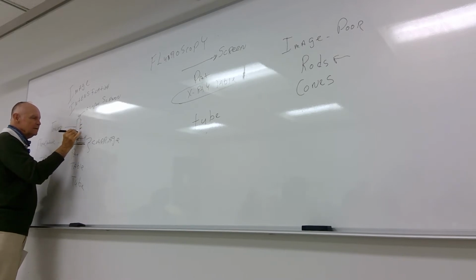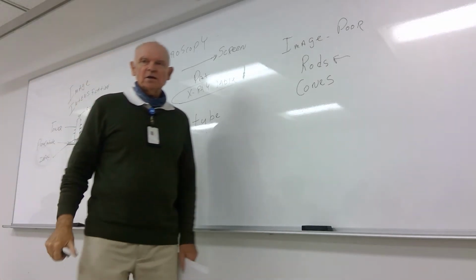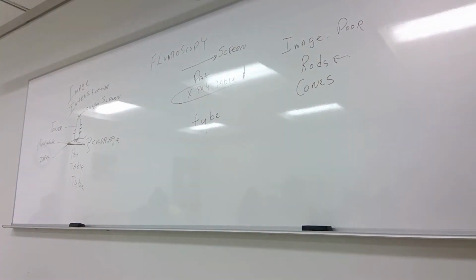I like your thinking, but no. There's something there called electrostatic focusing lenses. They have different types of charge on them that move the electrons up the tower.